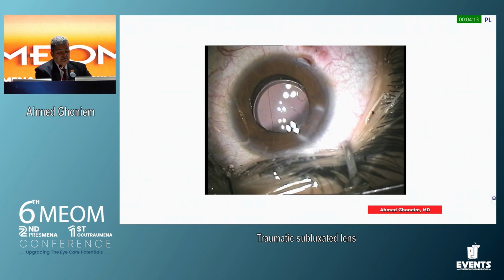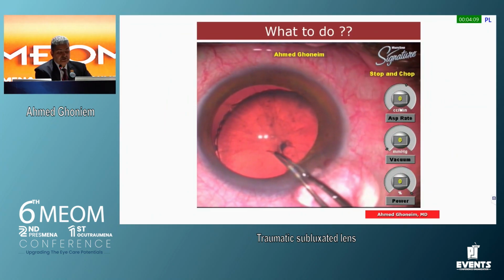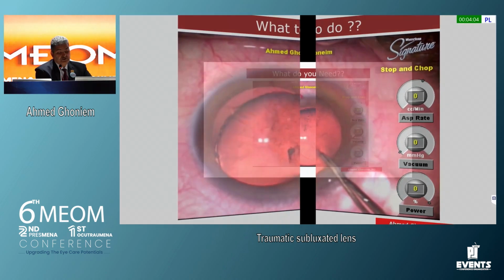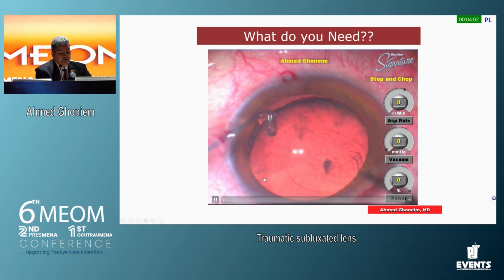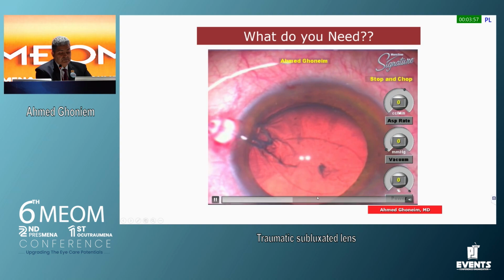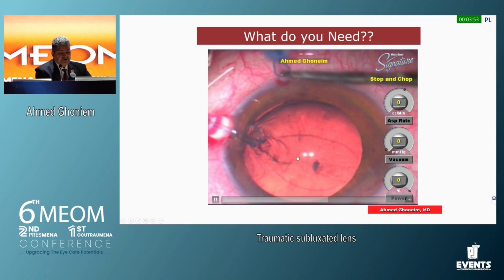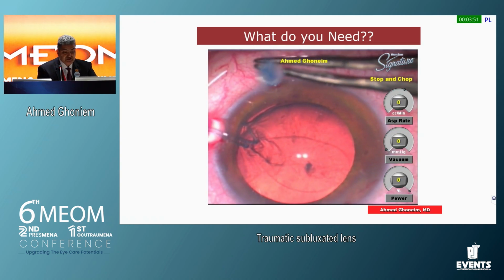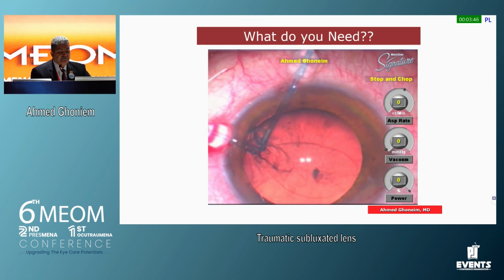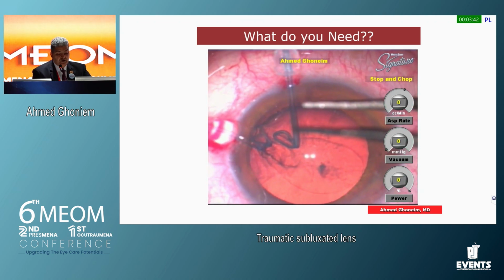And this is the final. Okay. What about if we still need more? I think we have to use, in such cases, sometimes with more or less hard cataracts, the capsular hooks, which are totally different from the iris hooks. You just implant, and you have to adjust, not to be short. And this is a trick I have to say: putting the capsular hooks in the bag, you have to not have it tight, not loose, to give the malleability of the bag.